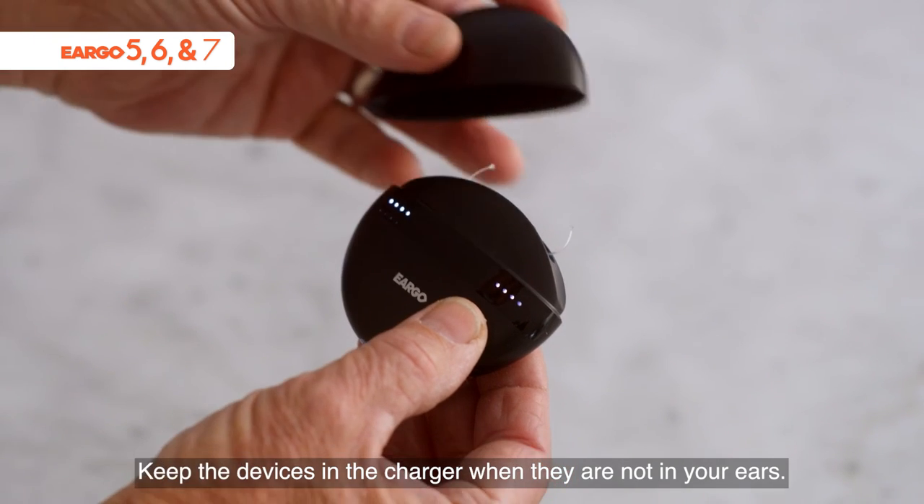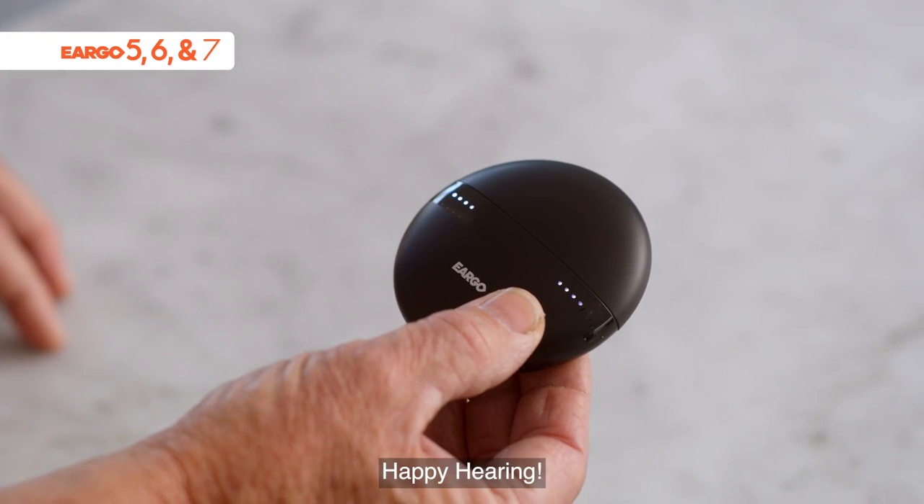Keep the devices in the charger when they are not in your ears. Happy hearing!